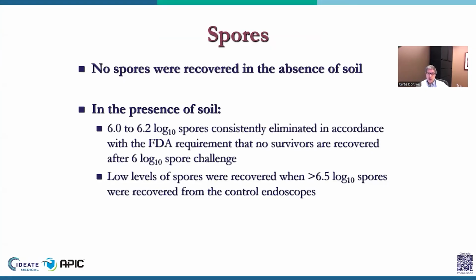For spores, no spores were recovered in the absence of a soil load. In the presence of soil, we consistently saw that 6 to 6.2 logs of spores were eliminated, in accordance with the FDA's requirement that no survivor should be recovered after a 6-log challenge. When we used higher inocula of spores, greater than 6.5 logs recovered from the control endoscopes, we did sometimes recover spores. So we were able to make the sterilizer fail with a very high level of challenge.